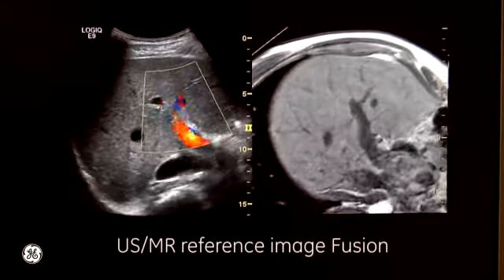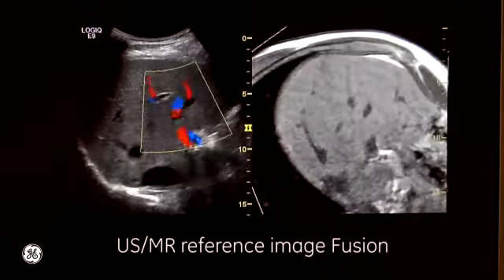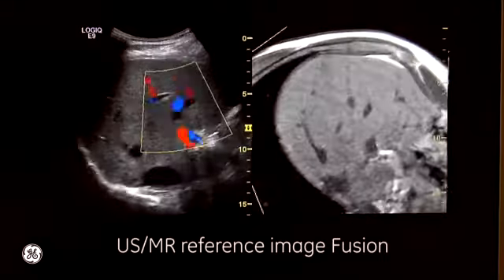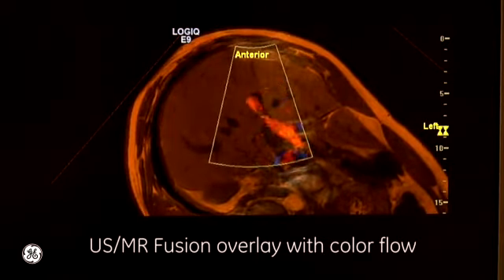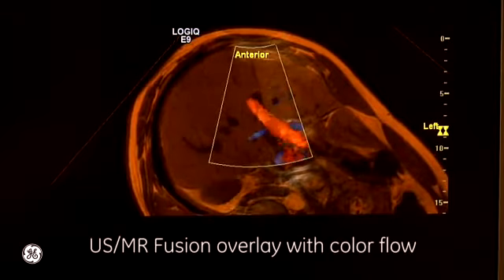With that, you can also add color flow. So if there's an area of interest that you're looking at vascularity, you can add color flow onto your real-time image while you still have your MR fused with it. You do have the opportunity of now overlaying on top of the MR to anatomical reference. With that, you can also add color flow if it's desired.